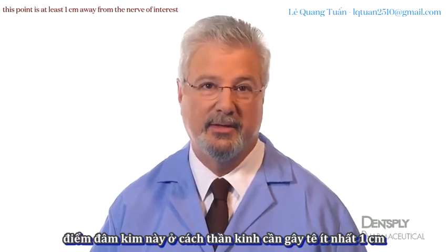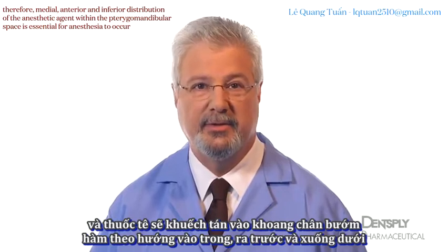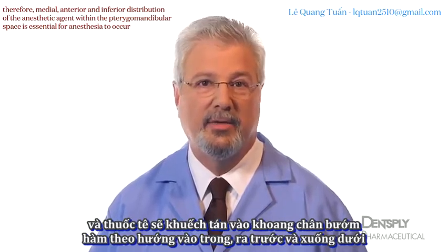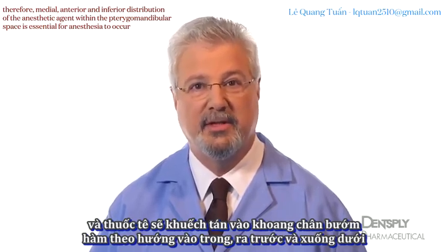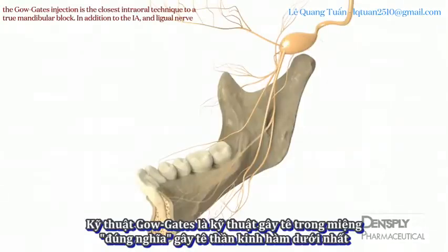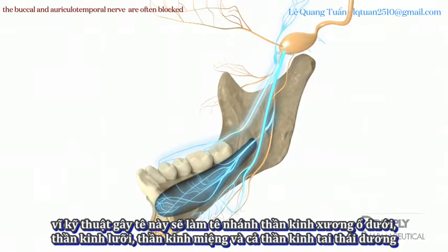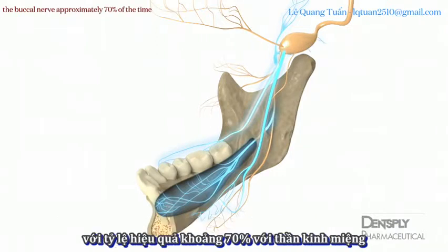the nerves of interest. Therefore, medial, anterior, and inferior distribution of the anesthetic agent within the pterygomandibular space is essential for anesthesia to occur. The Gow-Gates injection is the closest intraoral technique to a true mandibular block. In addition to the inferior alveolar and lingual nerves, the buccal and auriculotemporal nerves are often blocked, the buccal nerve approximately 70% of the time.